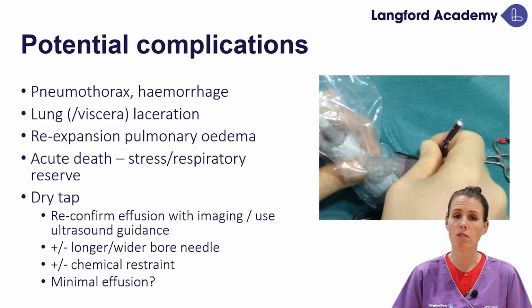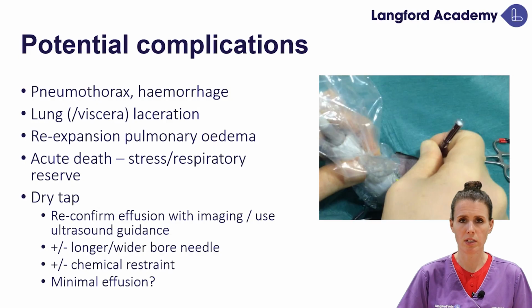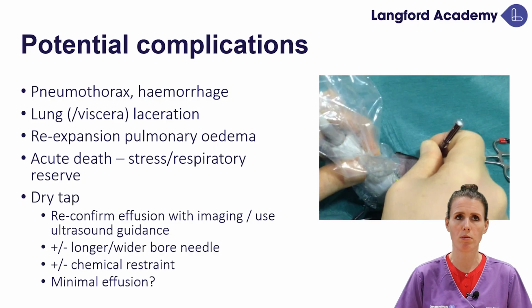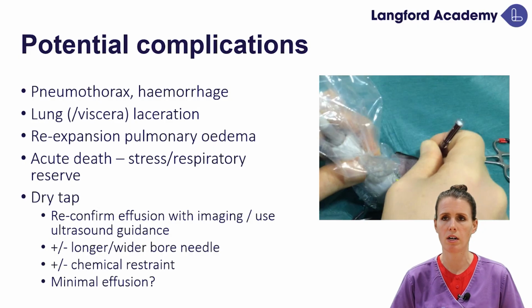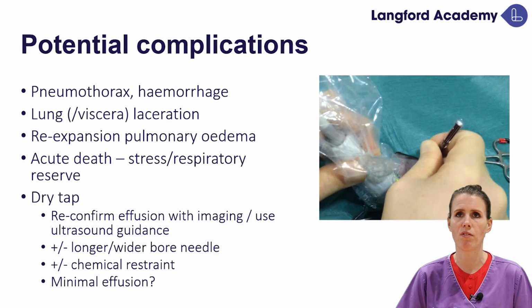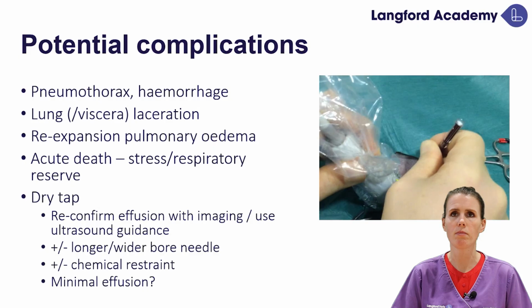And then if they've got a really low volume effusion that is not causing a clinical concern, but ultimately you were sampling diagnostically, perhaps consider revisiting that in a day or so's time if you need to do it then, if you've struggled the first time.